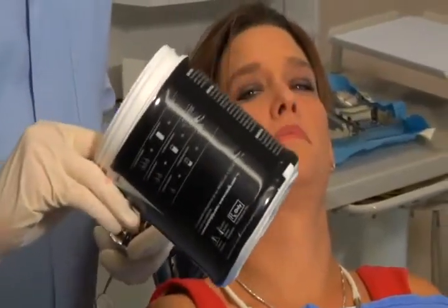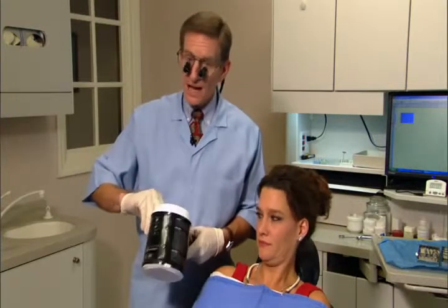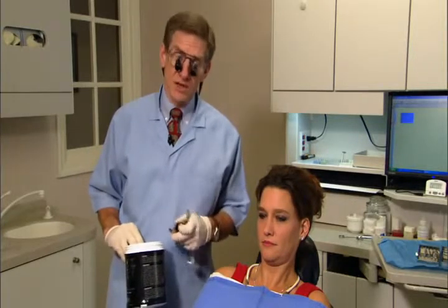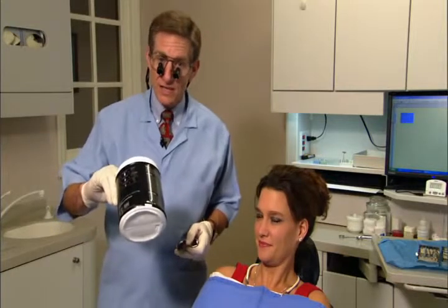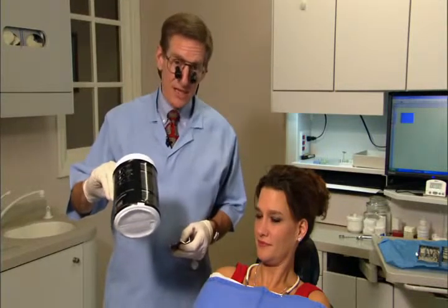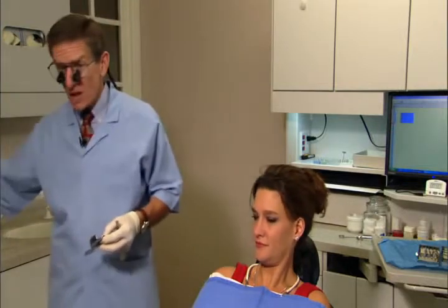All alginate comes in a container with mixing instructions on the back of the can — follow them. I always ask course participants how long regular set alginate takes to set, and I hear everything from 30 seconds to an hour and a half. Right here on the back of the box, it gives you the working time and set time. Set time for regular set alginate at 68-degree water is 3 and a half minutes.